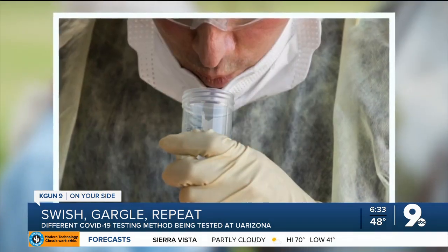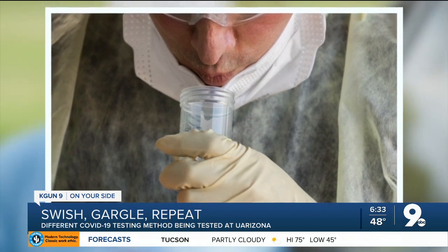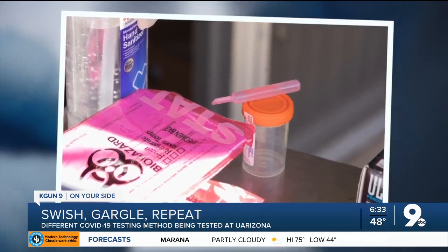All the patient has to do is swish and gargle salt water for three different cycles, spitting it in a tube. In our hands, it's turned out even better — it looks like it's about 20% more sensitive than the nasopharyngeal swabs. Warby says the testing method is headed to a clinical lab at the University.